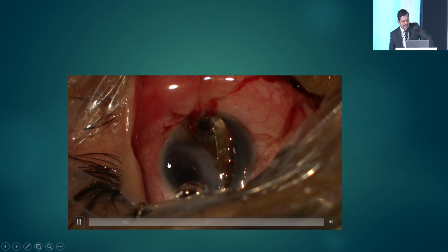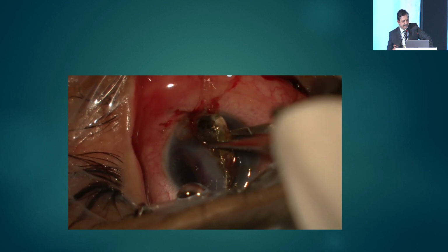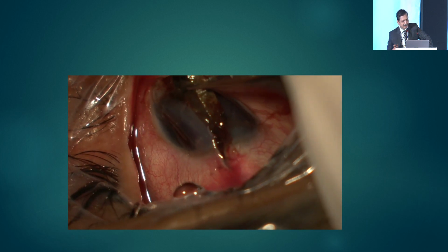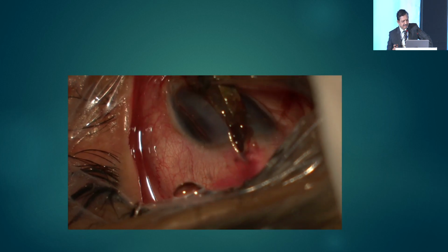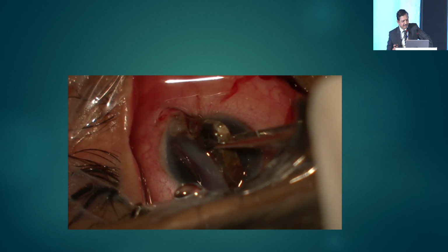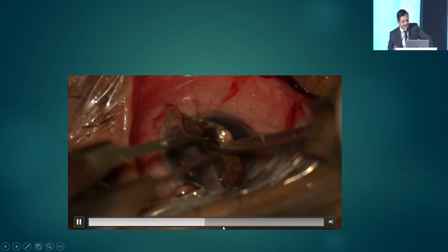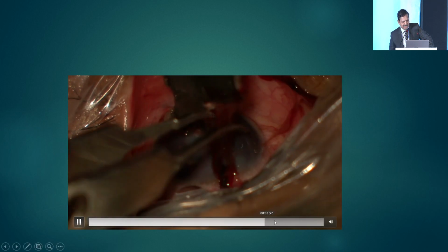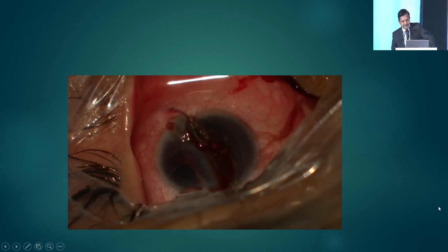This is just to show that a foreign body can enter like this, a large foreign body through the cornea from the limboscleral to the corneoscleral on either side. And as you see here, it's a little difficult to take it out, even though it is protruding out. Yeah, this is my last slide. So this is the foreign body which is there.